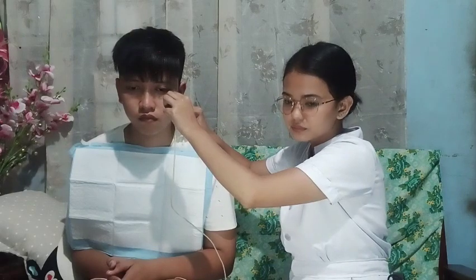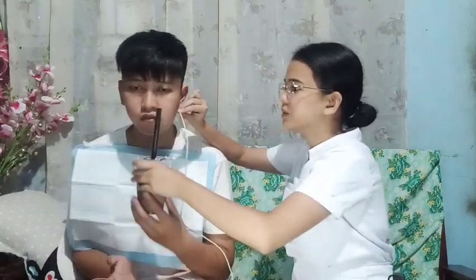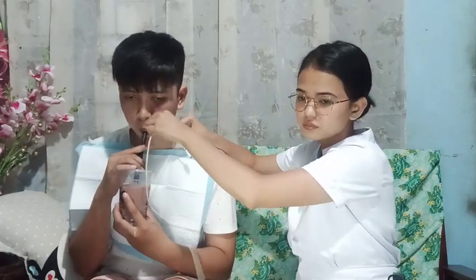Then after the tube reaches the nasopharynx, allow the client to swallow. Instruct the client to swallow. Okay, sir, inom ka po habang ini-insert ko po itong. If obstruction is felt, pull up the tube and then try the other nostril if there is obstruction. Pull. Then put to the other nostril.